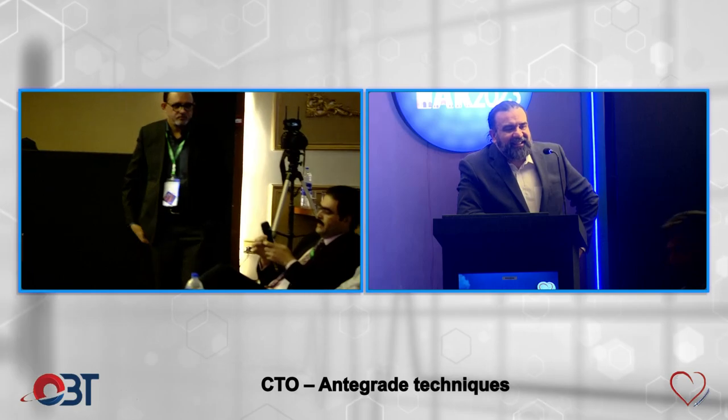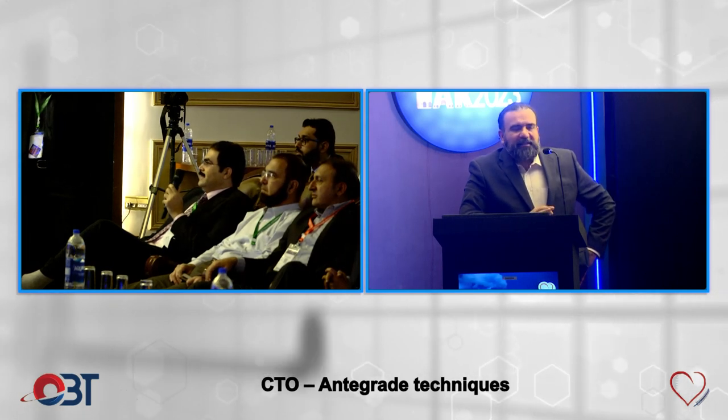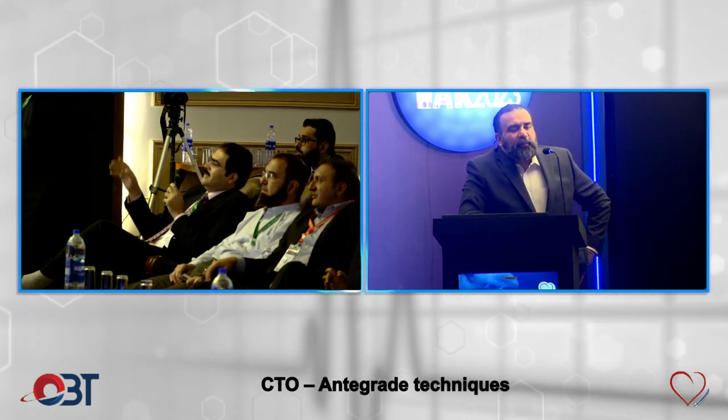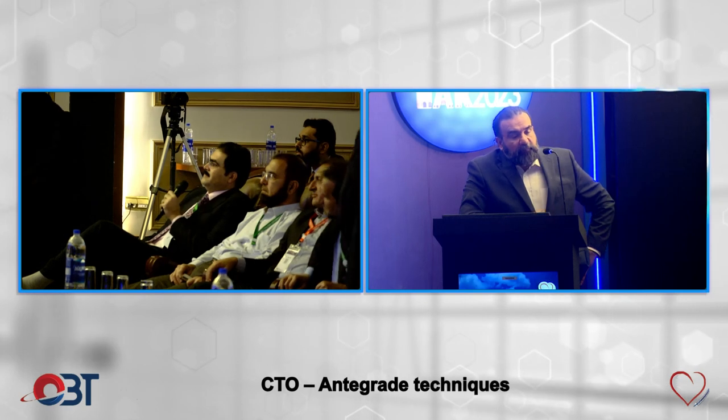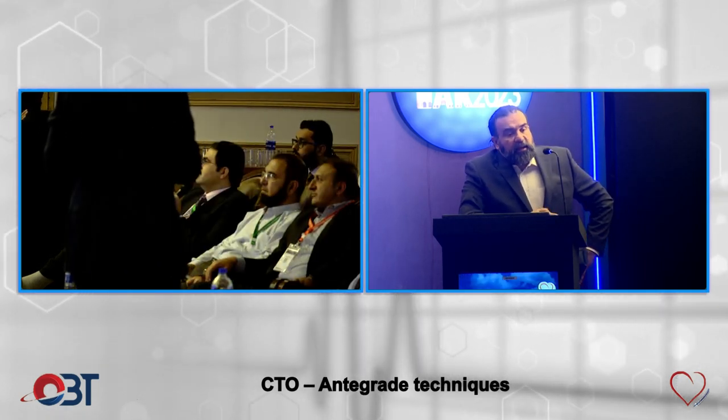Yes. The difference between tip injection and Carlino, how to differentiate between these two? You will only know by doing it, because I don't think you can tell beforehand. But the point is, if you do a tip injection and inject the contrast, and it ends up being a tip injection, there's no problem because you know you're close to the cap, you can then use your stiff wire to go just beyond it and then inject again. You're absolutely right. But it's very hard to tell before.